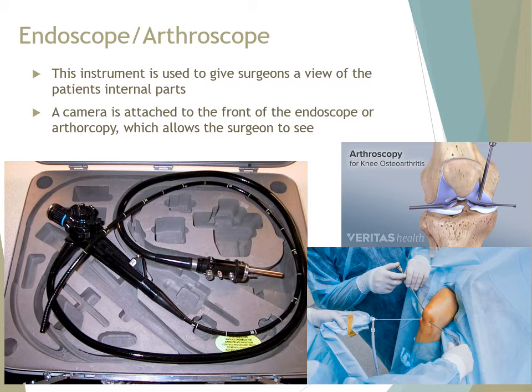So we shave, and then we sterilize, and then using aseptic technique, that's when you can do the puncture. And even if it's adequately prepared, we still give antibiotics, oral antibiotics, to prevent infection, especially if you're considering that this patient has, for example, an infection in the joint. So you still need to give them.